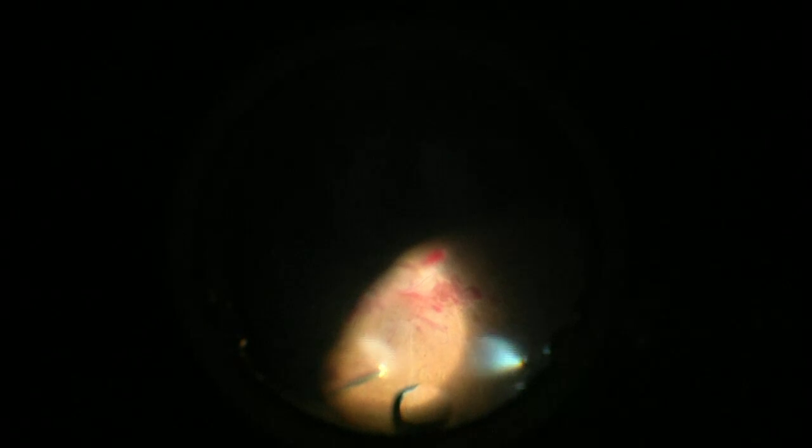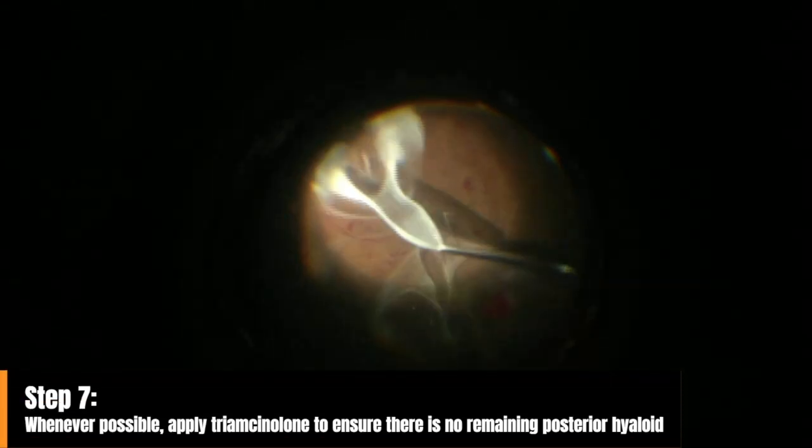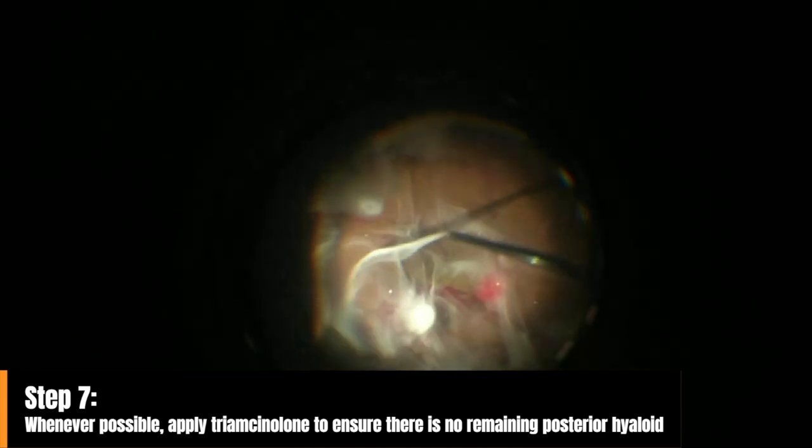Now look, once you have finished dissecting these membranes from the posterior pole, you can easily elevate the remnant posterior hyaloid and finish the vitrectomy, which will be the next step. Whenever possible, use triamcinolone to be sure that there is no remaining posterior hyaloid.